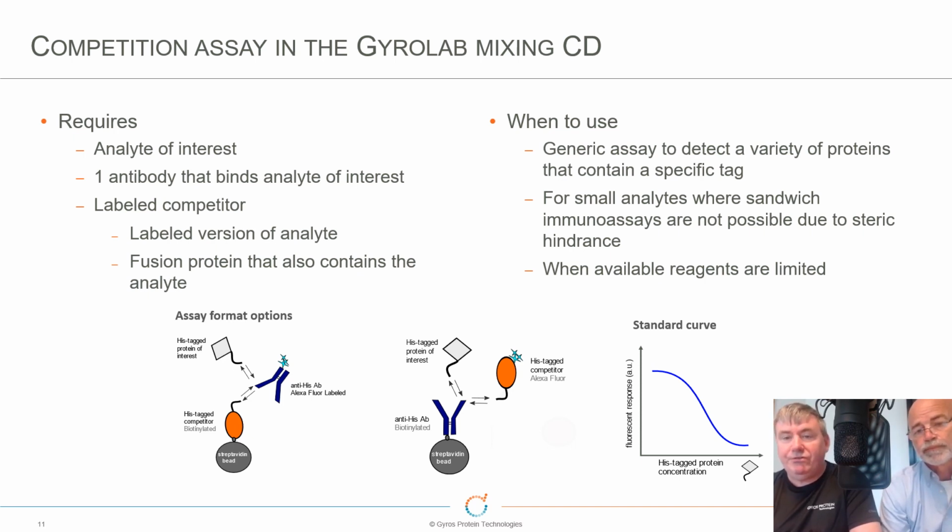So in this case, we've actually tried two assay formats. Where we have the antibody on the column, and then you pre-incubate, you compete the analyte and the labeled version. You can de-equilibrium the reaction by pre-incubating the unlabeled first and then add on the labeled. That sometimes improves sensitivity. And what we also have done is have the labeled version on the column, and then we pre-incubate the analyte and the antibody offline and then run it over the column. So there's a lot of flexibility.